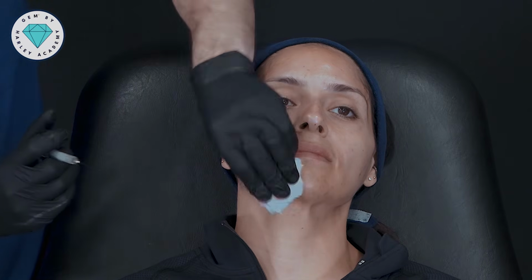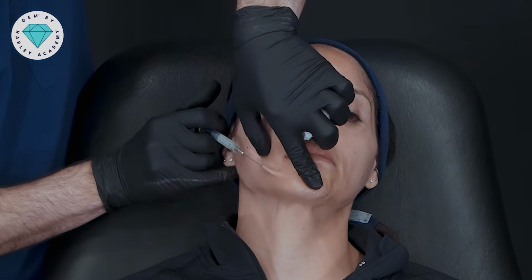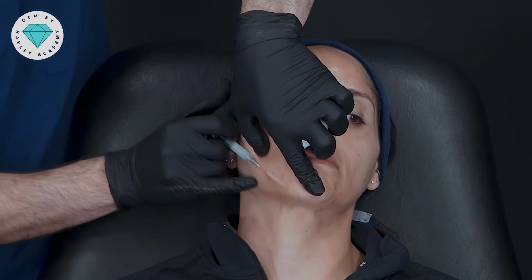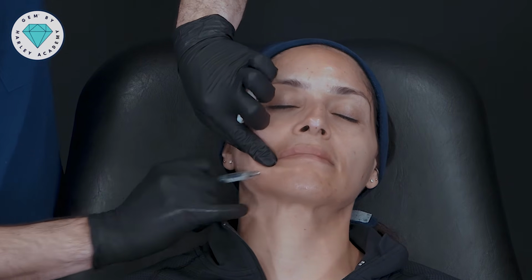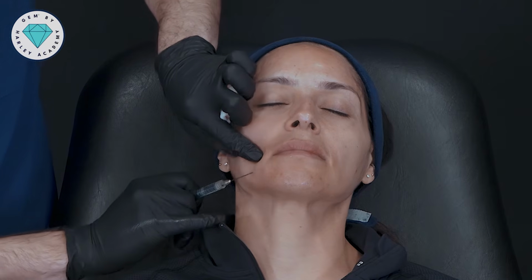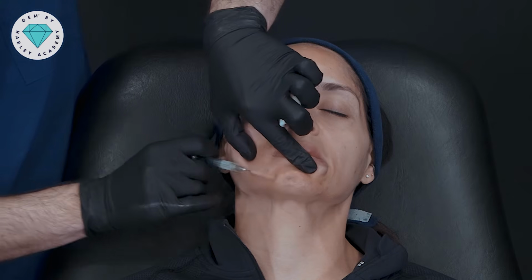Okay, so this is just a little finishing touch that I want to do, which is just to create a little sheet of gel, hyaluronic acid gel, on top of the DAO muscle and on top of the mentalis muscle. And this just helps to really reduce some of that expression and soften the lower face, which I think will just create this final harmony for the treatment that we've done. So nothing complicated here. I'm just fanning into layer 2.